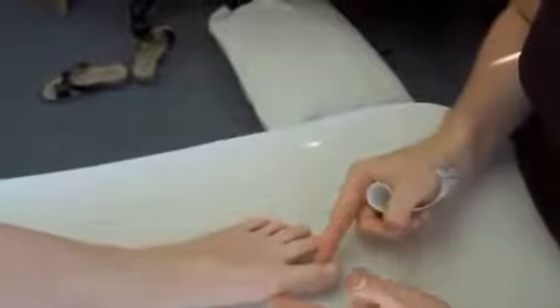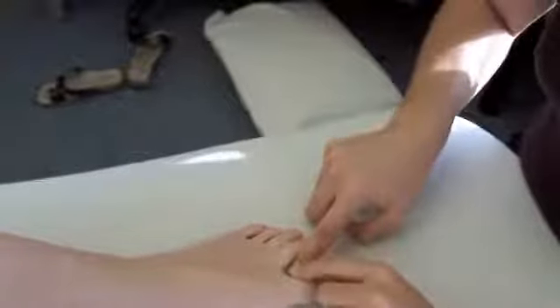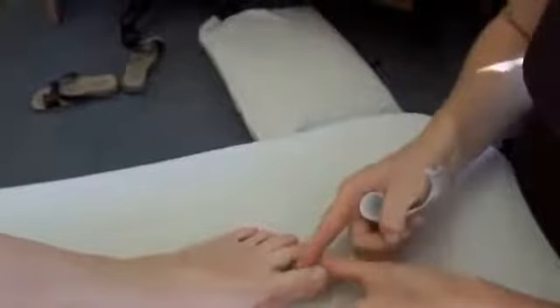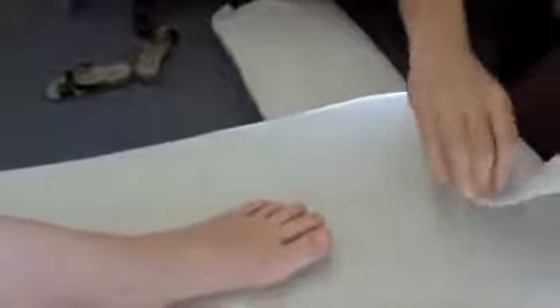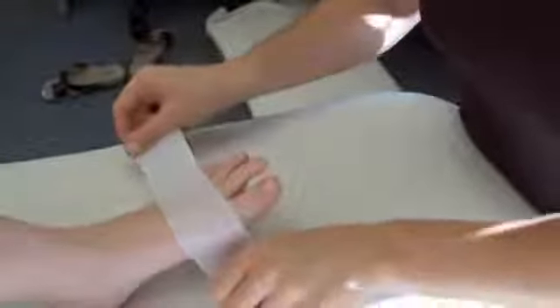So we're just looking at our bunion taping here. If you look at the bunion, it comes in like that — we want to just straighten up this toe joint. If we just put a toe spacer in, it tends to push them apart and gets worse over time, so you actually want to correct it. We start off with a bit of tape around the main part of the foot.